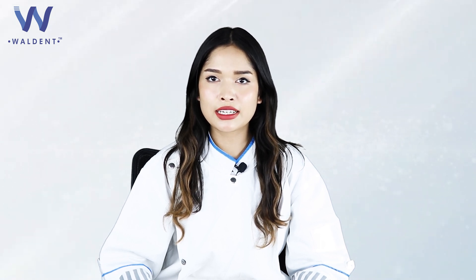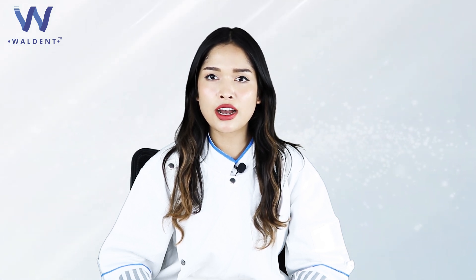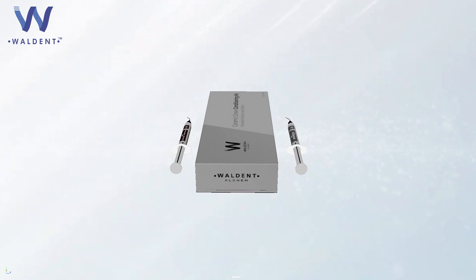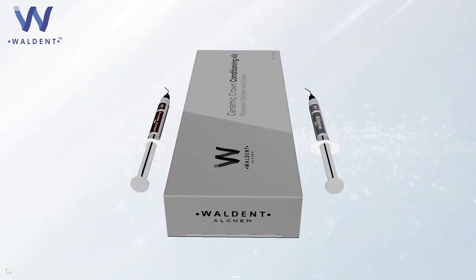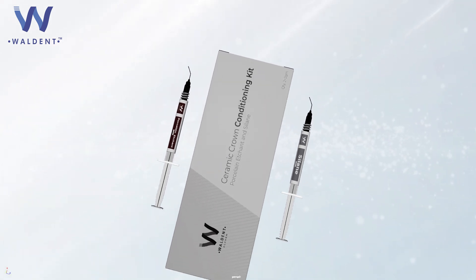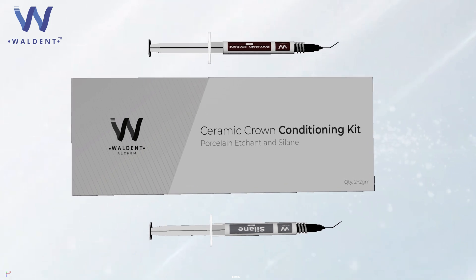The Walden Ceramic Crown Conditioning Kit comes with a porcelain etching, which is a 9% buffered hydrofluoric acid used to etch porcelain veneers, crowns, bridges, inlays, and fractured dental porcelain, and a silane primer, which is a single component coupling agent used after hydrofluoric acid etching to prepare the surface for bonding resin.